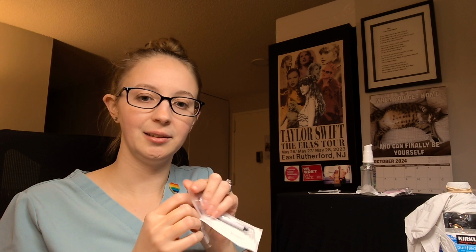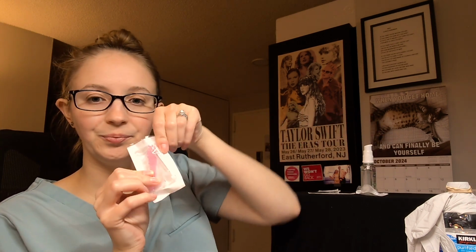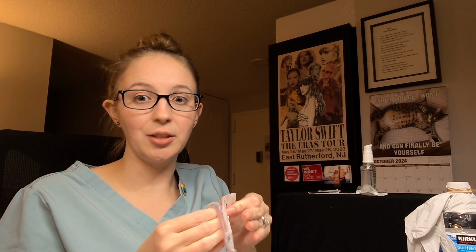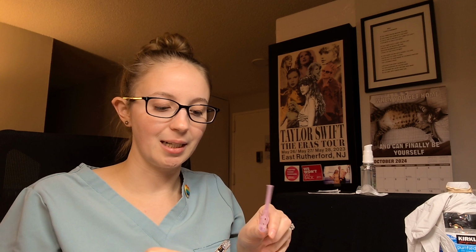Now you're going to go ahead and grab your syringe. Usually the 1 ml syringe is perfect. And your 18 gauge needle. This big needle is just to draw up. Please do not inject yourself with it. Additionally, if you prefer, you can draw up with the same small needle that you inject with. This just sometimes makes it easier to get the medicine up.